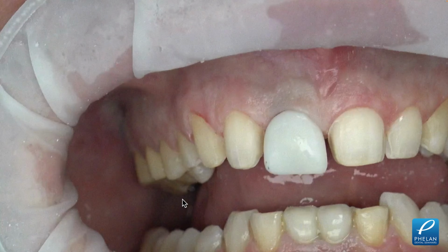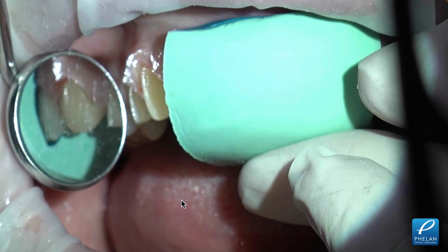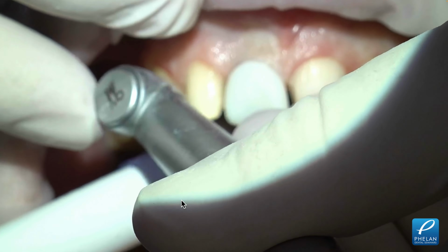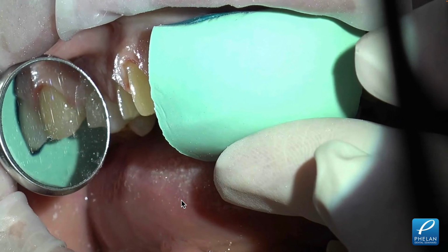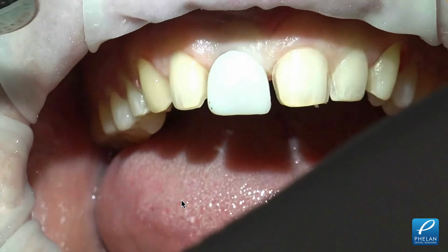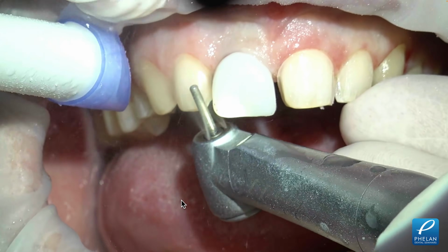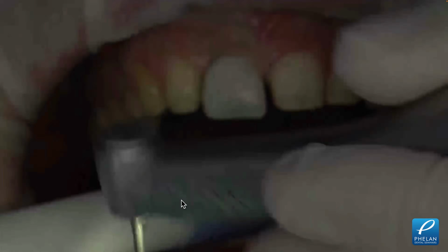So here's a little video. This was filmed about 3 years ago. You can see depth of preparation looks pretty good, just needs a little more incisal third change. This was shot with a different video camera, not quite as clear, beautiful videos as what I'm getting now with the Nikon Z9, but still pretty good.